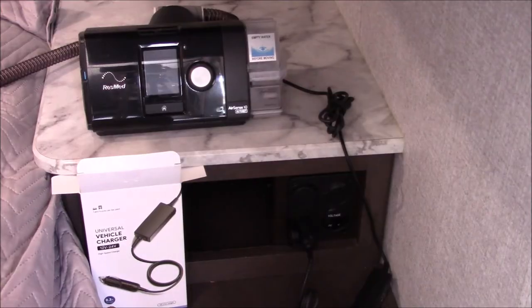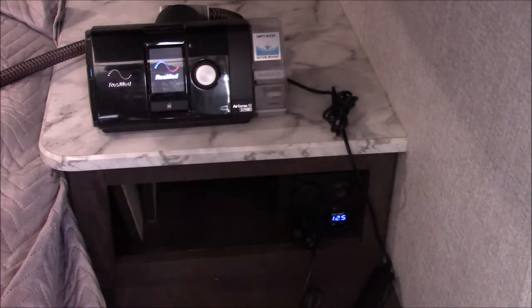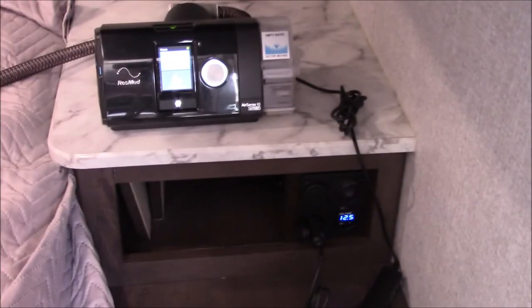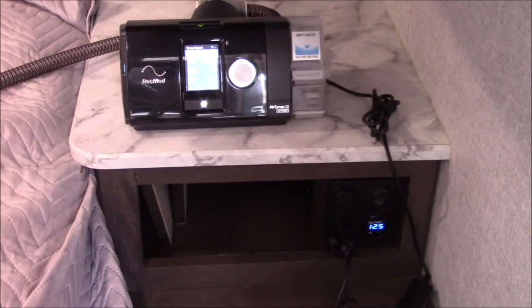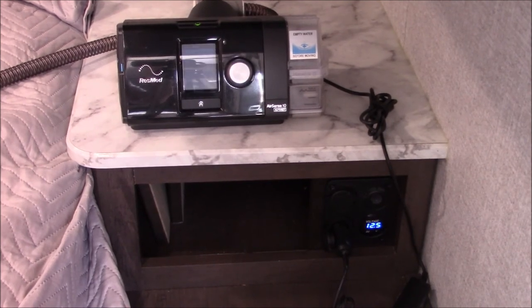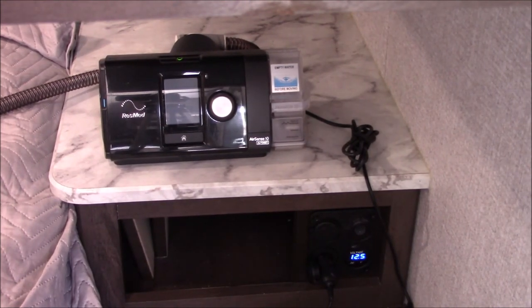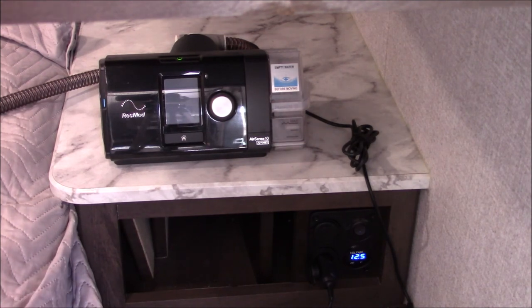I'm all set to test it out. I have a converter that'll convert from 12 volts to 24 volts, which this thing needs, and it's powering up. I'm going to put my mask on and test it out. It works! You may want to contact your health provider to see if they can turn the heater off to save a little bit of battery power. I find it to be a success. I'm going to tape up the wires and box where my wires are, and then I'll be all done.